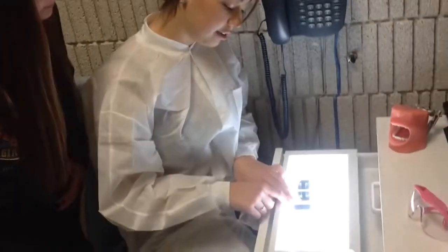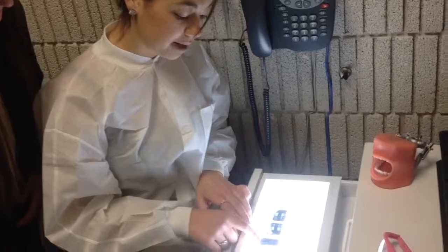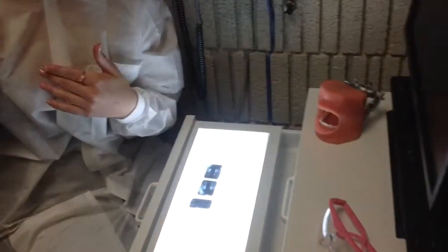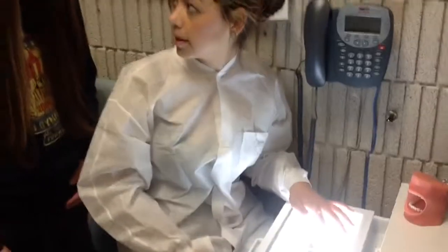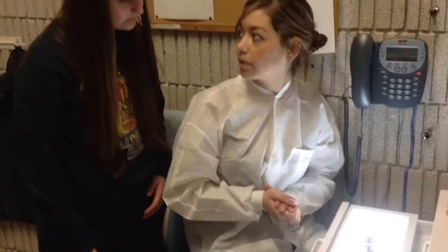And then this one right here, this is the x-ray that actually showed your front teeth from when you fell last week. And everything looks really well, but we are going to have the doctor come in, take a look, and explain in further detail with you and your mom. I just thought it was important to show you what they look like, so next time you have a little bit more of an idea of what we're going to do.